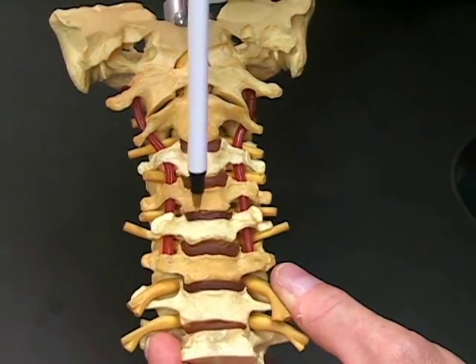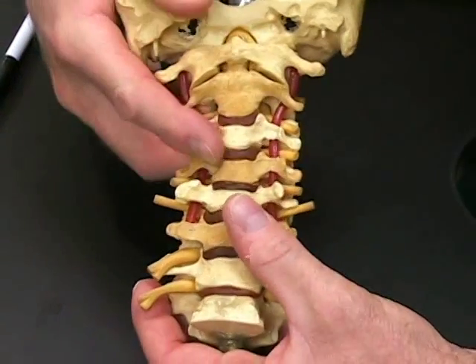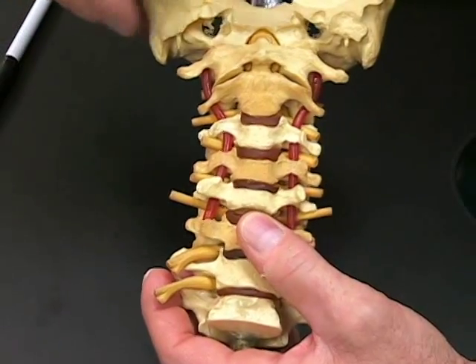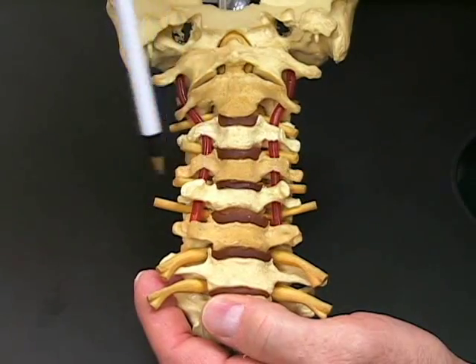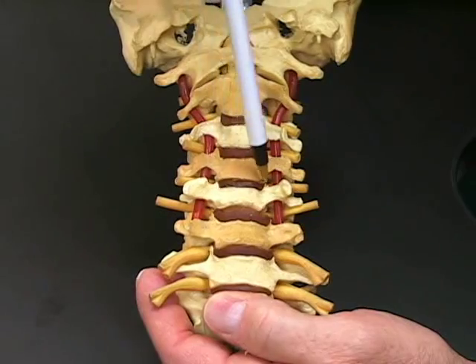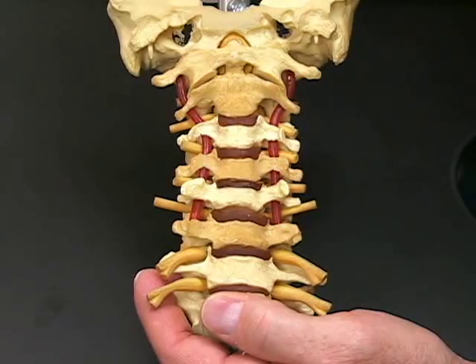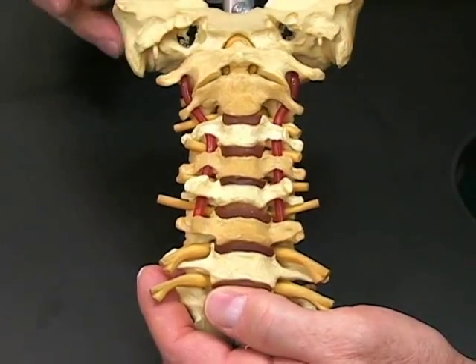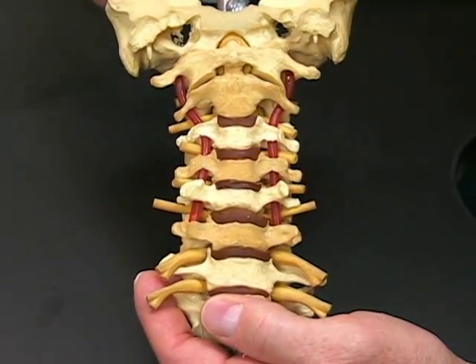Then under the operating microscope we can remove the disc material, and then we have a little instrument that will actually open the disc space up slightly so that we can see the nerve roots after we remove the disc material. Once we've removed the disc material and opened up the holes on both sides, and in some cases taken pressure off the spinal cord, we take a piece of bone graft that goes in the disc space, usually about the same height as the disc space. That bone is what we get from the bone bank, but we also do a little bit of drilling of your own bone, and that bone dust goes into the piece of bone that is then put in between the disc space.